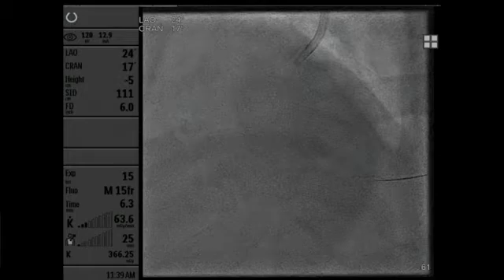And I think it's easier. I do, it's the proximal edge here. It's the proximal edge. Dilate a bit and then you can go back. True, that's what we're doing now. Yeah, or another, you'll get across if you pre-dilate. Hey, Rich, or Heather, you can do it by inching it.